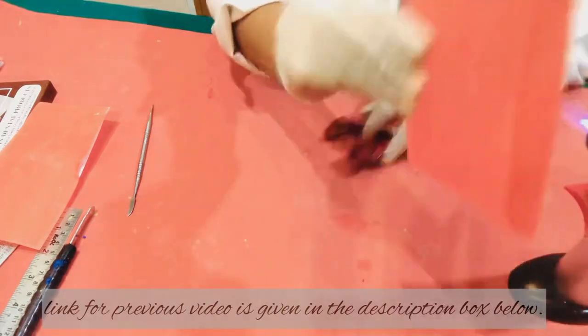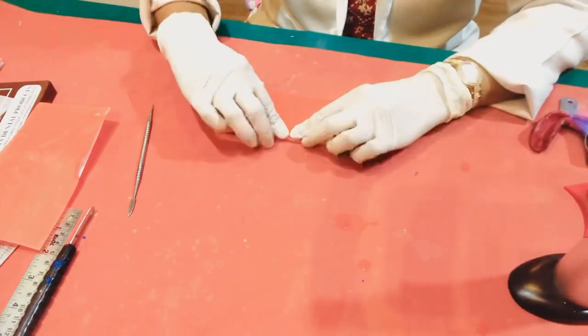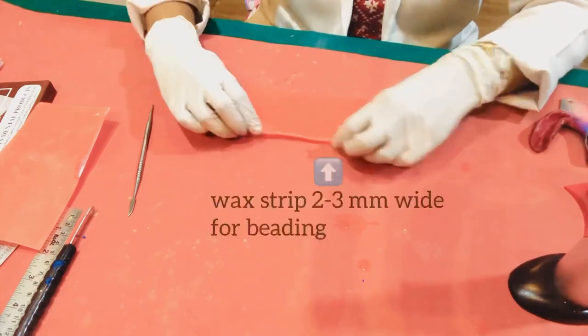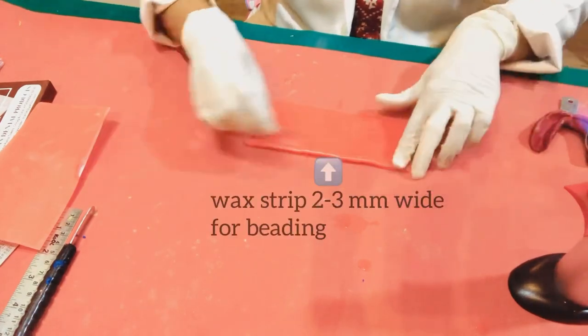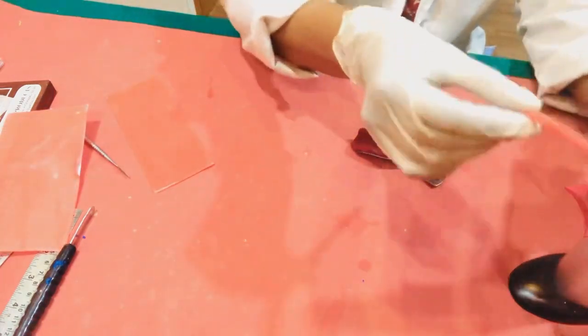Soften one edge of the wax sheet and fold it twice to get a wax strip of width two to three millimeters. Soften this wax strip over a flame and adapt it around the impression two to three millimeters below the border of the impression.